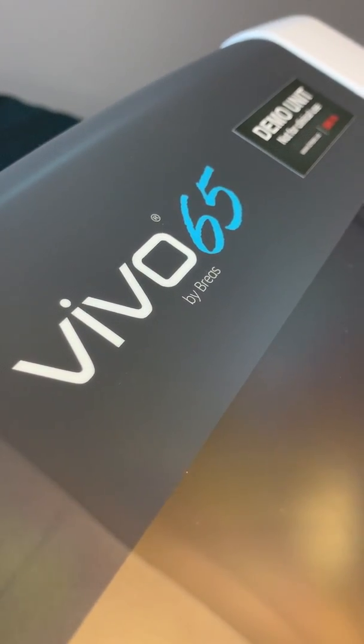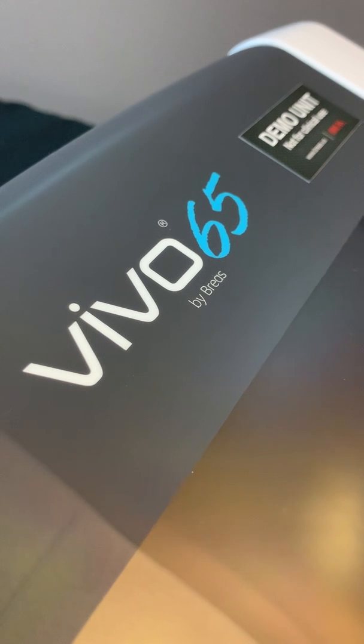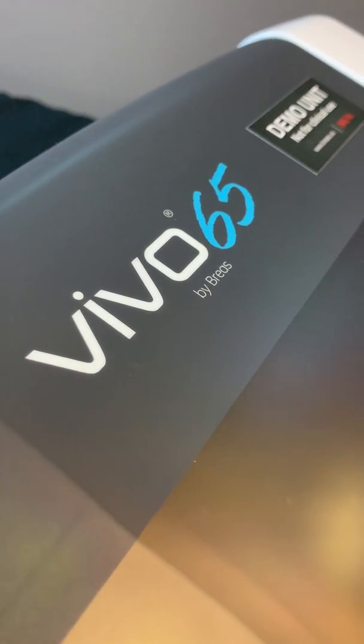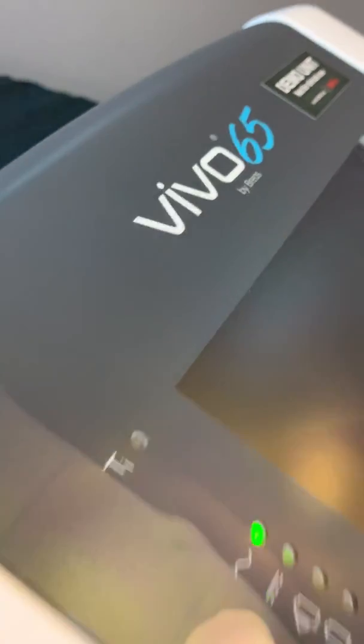Hello, my name is Michael Griggs. I am the Director of Clinical Services for Breas, and over the next couple of minutes I'm going to be going over the left panel of the Vivo 65.